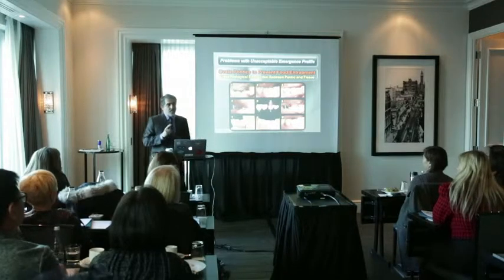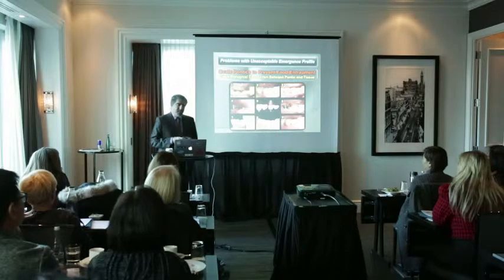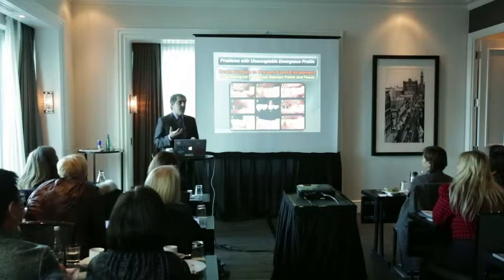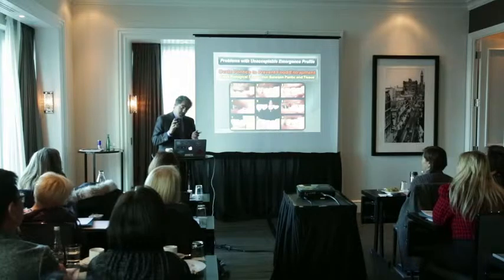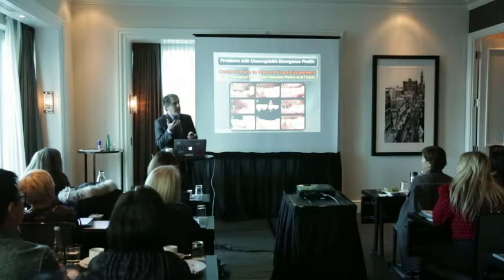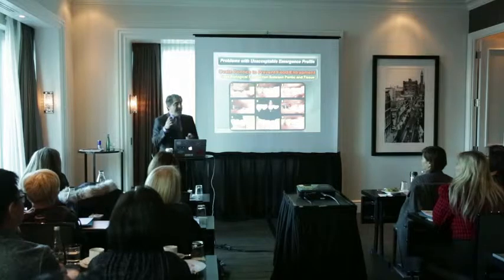One thing that you have to remember, and I think there's a misunderstanding about it: under any pontic, if you have a close contact with the tissue, there will be a weak hemidesmosomal connection between the surface of either the porcelain or metal and the gingival tissue.